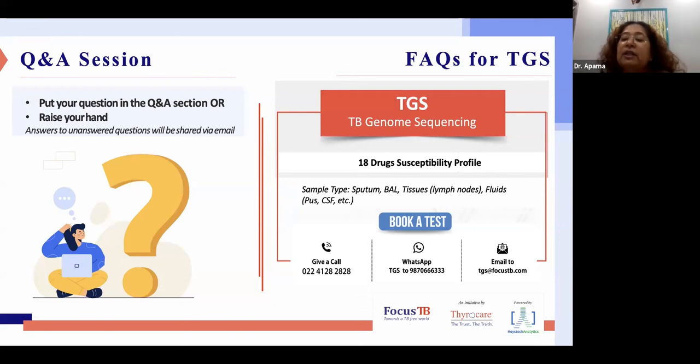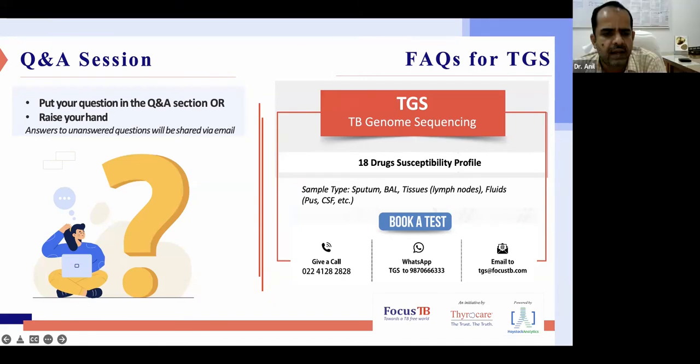With NTM, I doubt it gives the drug sensitivity details, but it will be able to tell you the species of the NTM, because I believe there are more than 125 different species of non-tuberculous mycobacteria, previously known as MOTT. Dr. Anil, you can correct me. But I was wondering whether you can look at the resistance genome associated with clarithromycin resistance. If you look at that part of the genome for mutations, you could actually comment on the susceptibility to clarithromycin at least.